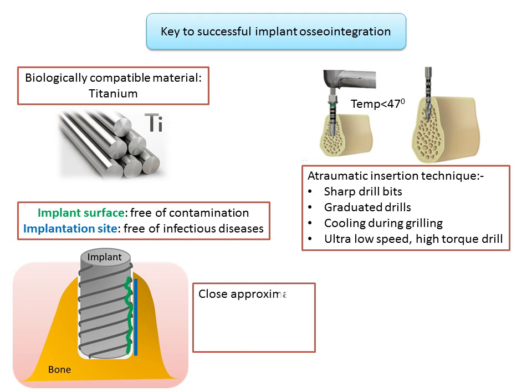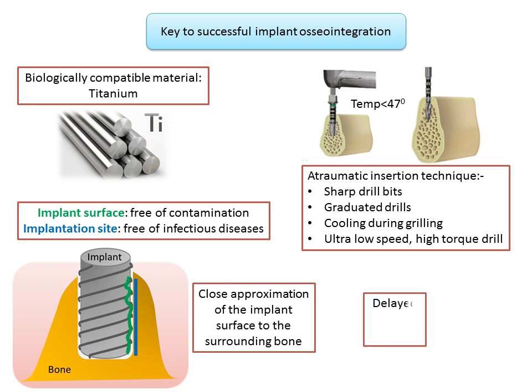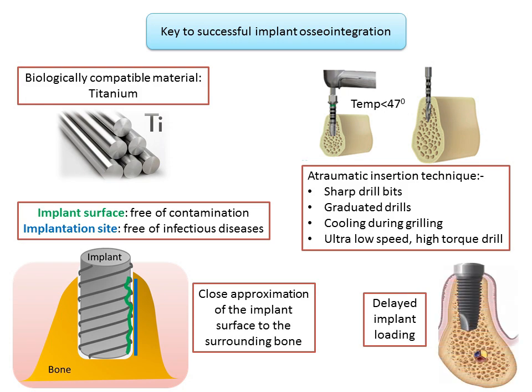Close approximation of the implant surface to the surrounding bone, which includes precision in site development and implant insertion and tapping of dense cortical bone. Delayed implant loading, that is prosthesis placement, gives time for the biological process of osseointegration to occur.